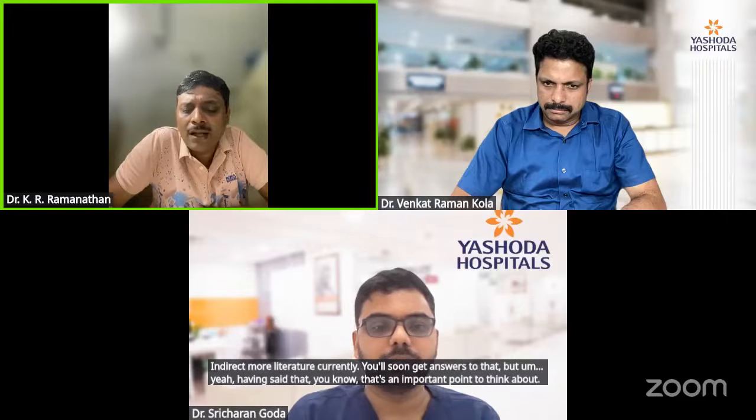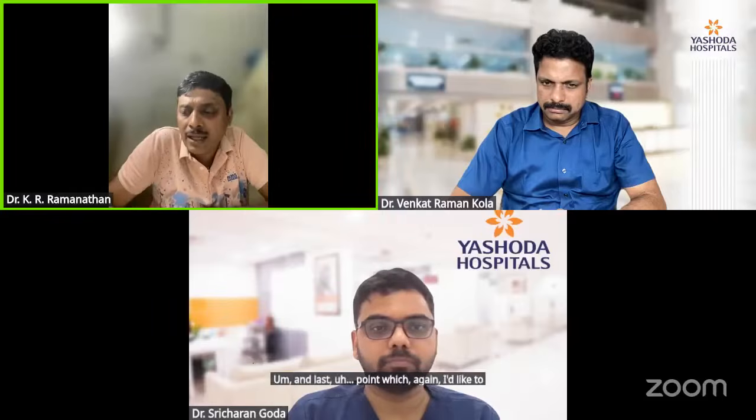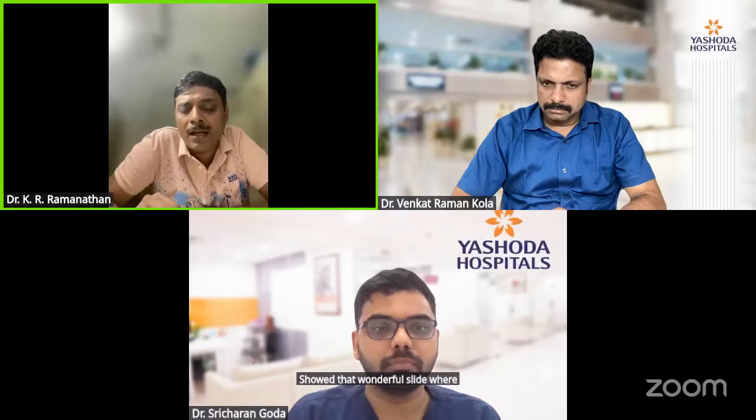And the last point which I'd like to highlight: Sricharan showed that wonderful slide where LV unloading was indicated. I would rather rephrase that slide as absolute indications for LV unloading, because those conditions which Sricharan listed there essentially would need LV unloading at all costs.